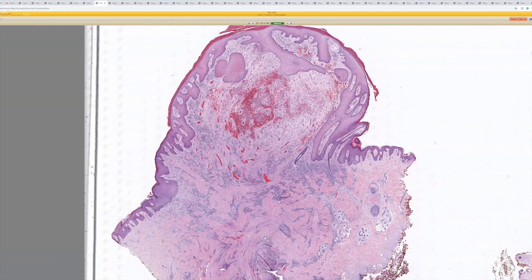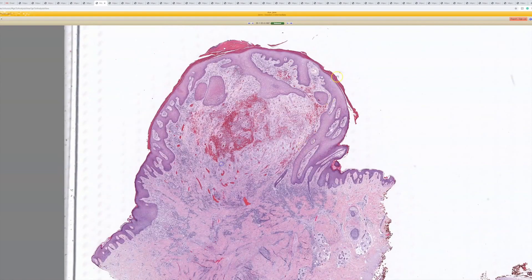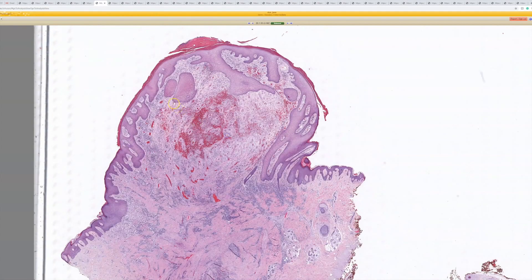There are other entities that can certainly have overlapping features with this. If this were anywhere else on the body, it's probably just a ruptured cyst or ruptured hair follicle — they've really manipulated and picked at it and gotten a lot of reactive polypoid granulation tissue and reactive epidermal change over it. So: pilonidal cyst or sinus tract.